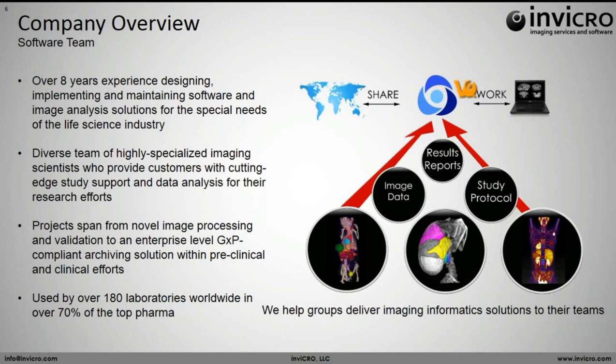Currently they're being used, either VivoQuant, the iPACs, or both, in over 180 laboratories worldwide, including over 70% of the top pharmaceutical companies, and really providing an enterprise-grade solution for your data management, reporting, visualization, and analysis needs.